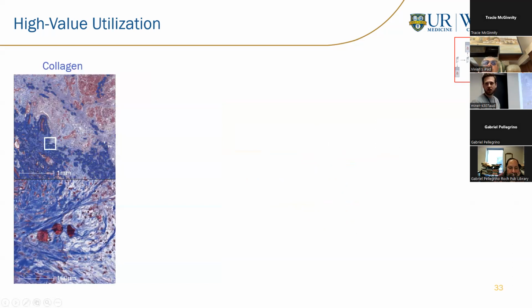And then the last part of this, another sequential slide. This is not an IHC stain. This is a stain for the desmoplastic stroma of pancreatic cancer, right? And it's somewhat hard to see here, but there's a blue line outlining some of this dark blue region, right? What this is, is a training of the analysis software. So you give this artificial intelligence algorithm some examples of, okay, there's no collagen in this region. There's light collagen here and dense in this region, right? You train it, you apply it to the entire slide. And what it can do is annotate and create these regions of dense collagen.